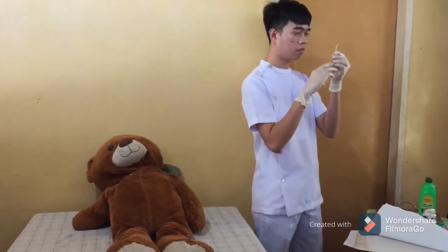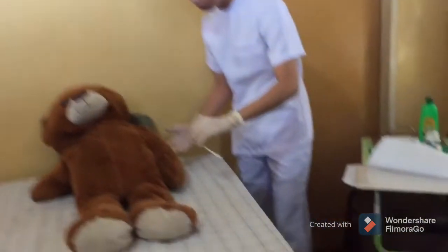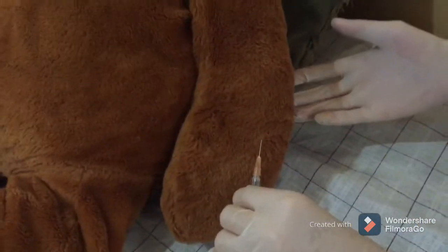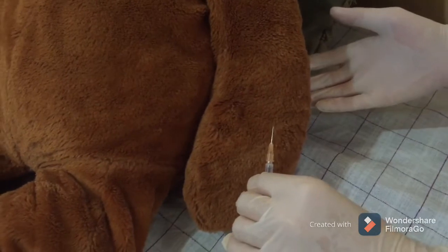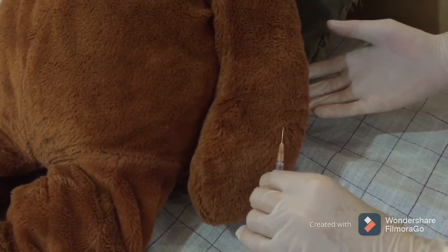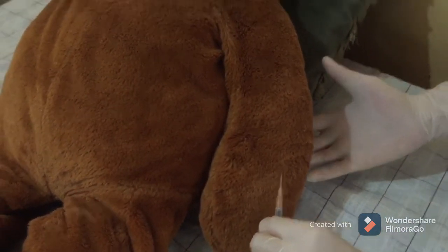Then we are going to grasp the syringe in our dominant hand, holding it between the thumb and forefinger. Then hold the needle almost parallel to the skin surface with the bevel of the needle up. We need to do this so that we can prevent injecting the medication into the subcutaneous part of our body. Then we are now going to inject the fluid.